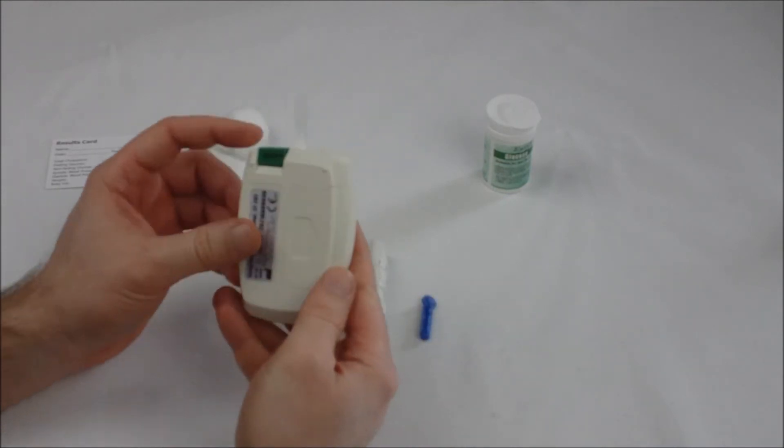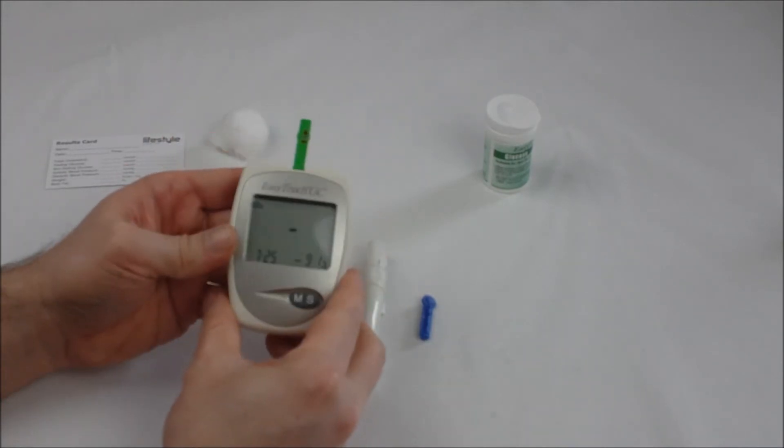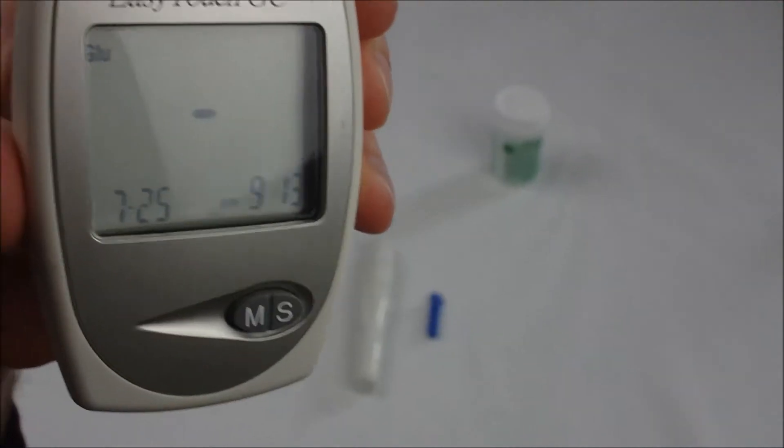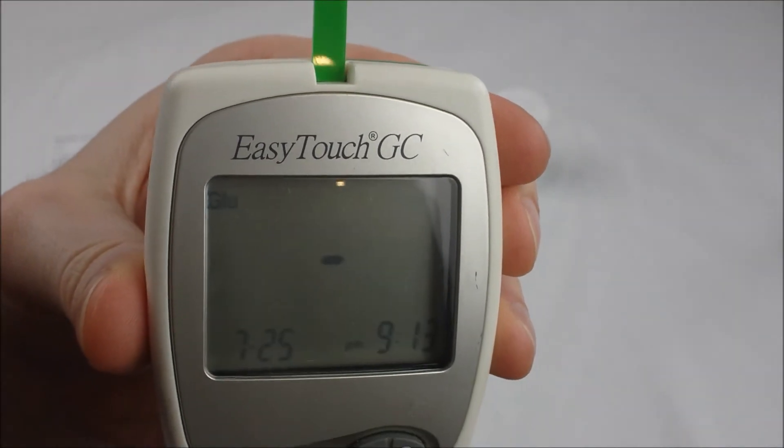That number should correlate with the number on your test strip and your code key. After that you'll see the blood drop symbol appear and your monitor will be ready to take the blood sample.